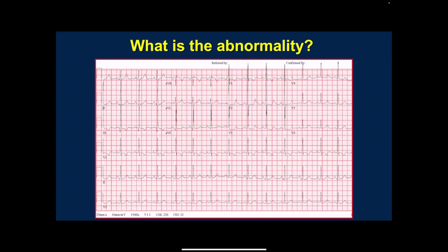Right ventricular hypertrophy. Yes. Do you see how long the QRS is? They're really, really long in V1. But then when you go towards V4, V5, V6, they're kind of becoming shorter. And they're really long in V1 and V2. So we're thinking right ventricular hypertrophy. Okay?